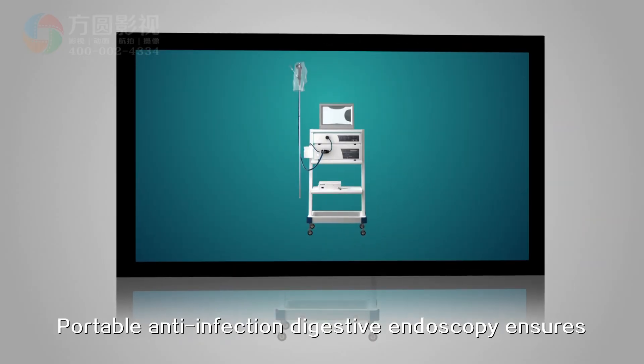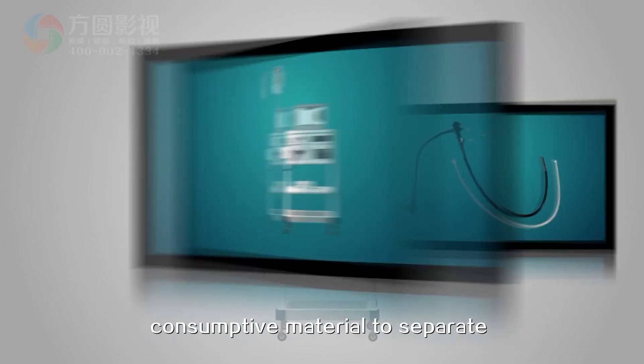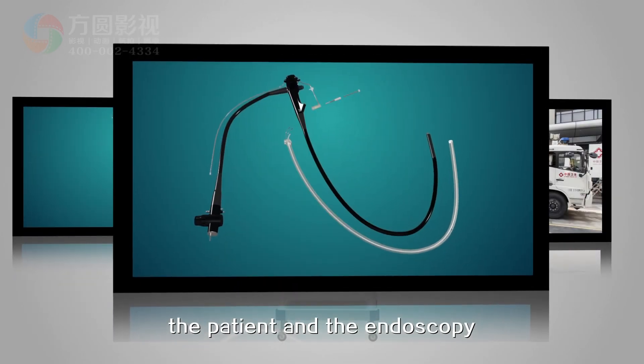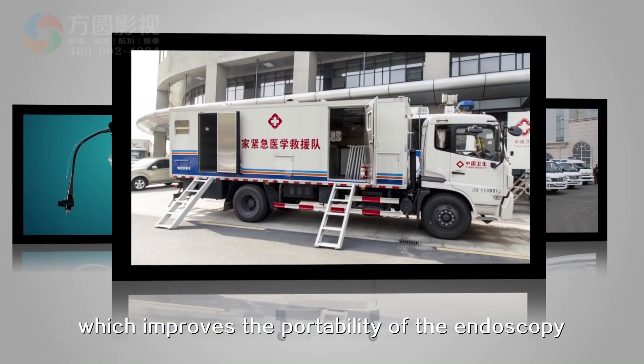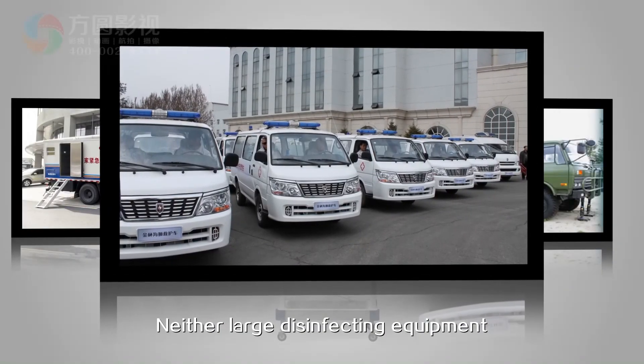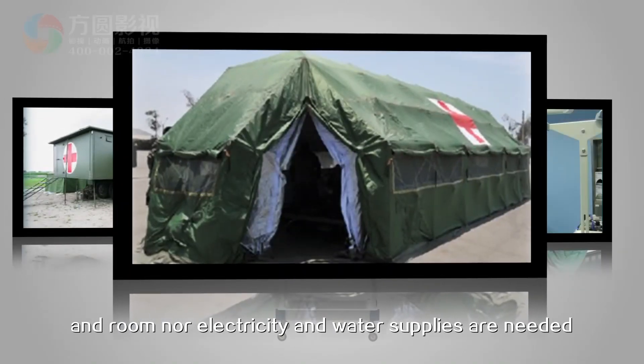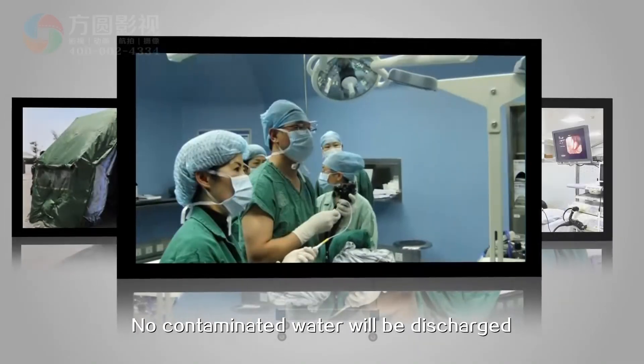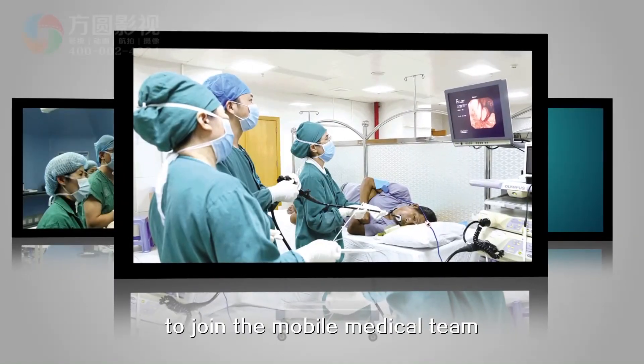Portable anti-infection digestive endoscopy ensures reliability by covering with consumptive material to separate the patient and the endoscopy. The consumptive material is small and easy to carry, which improves portability. It can be used under various conditions. Neither large disinfecting equipment and room nor electricity and water supplies are needed. No contaminated water will be discharged, which helps gastroenterologists to join mobile medical teams.